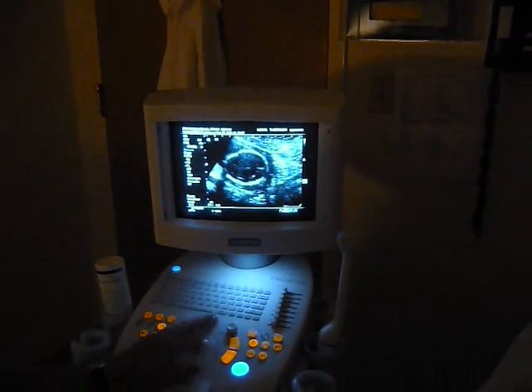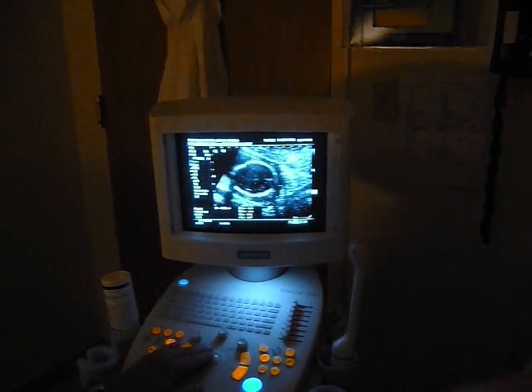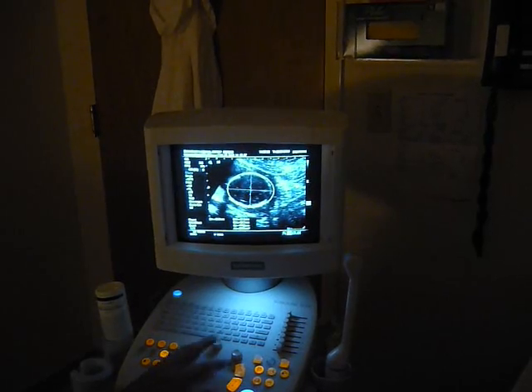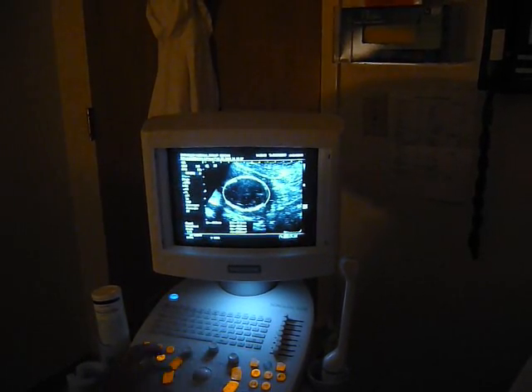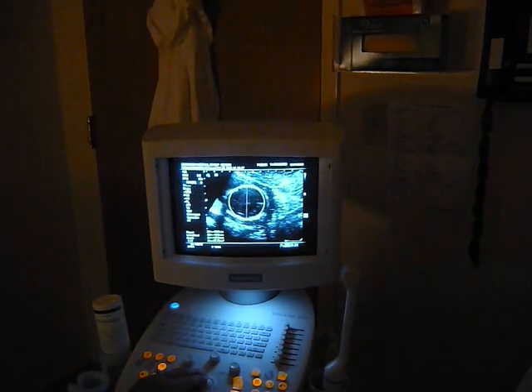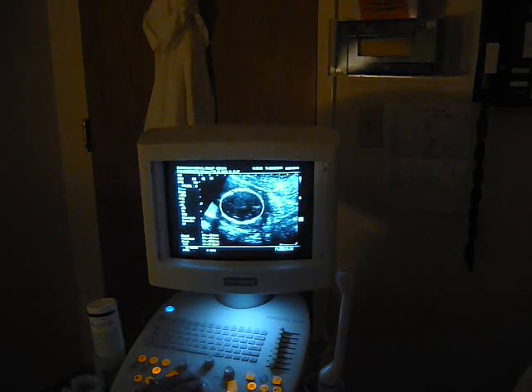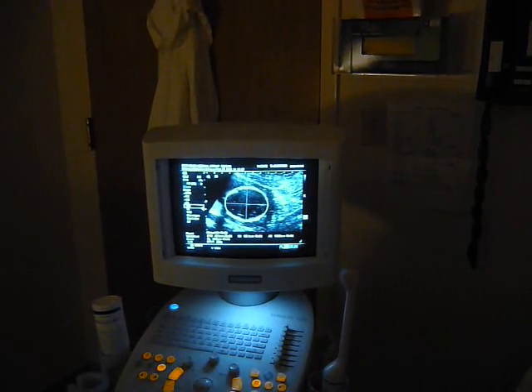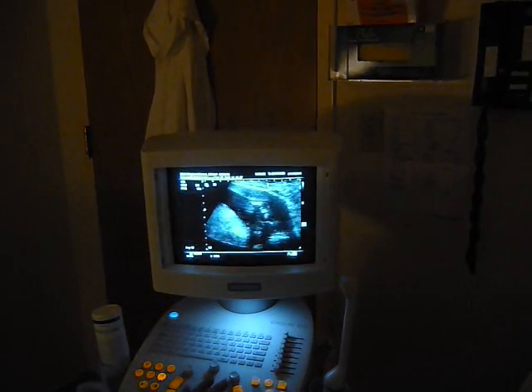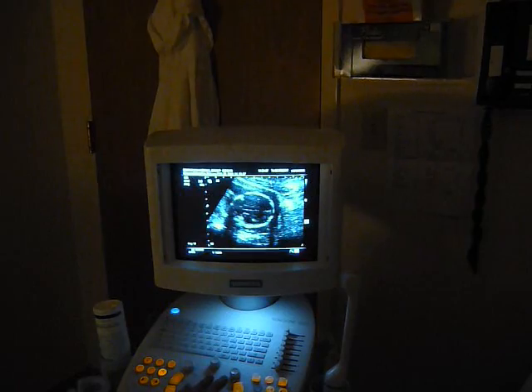This will just be top of baby's head here. We're going to measure from side to side. Yeah. And then also how round the head is. Everybody's head shape's a little different. Looks like he's got a nice... Brown head. Nice. Yeah, like Charlie Brown head. Charlie Brown head, yeah. I don't know what we call them when they're long and skinny, but the round ones we call Charlie Brown head.